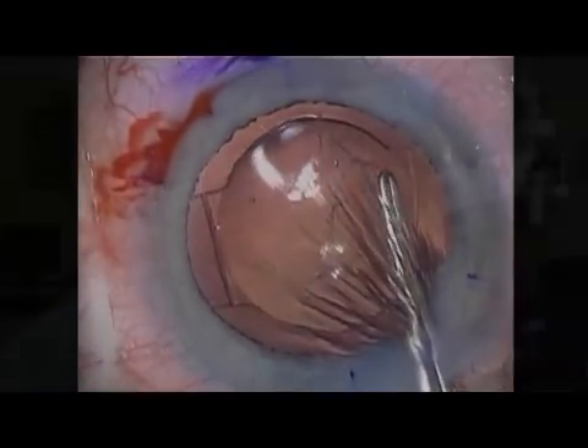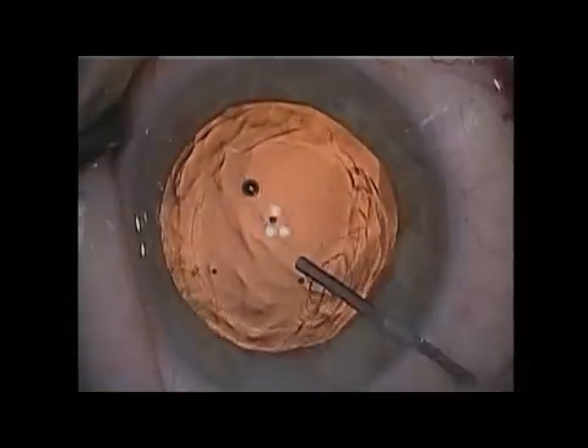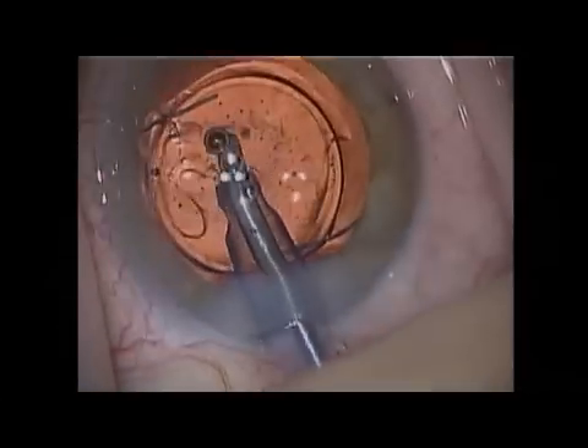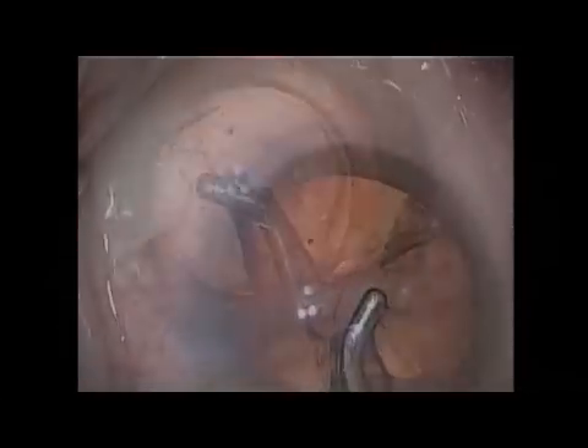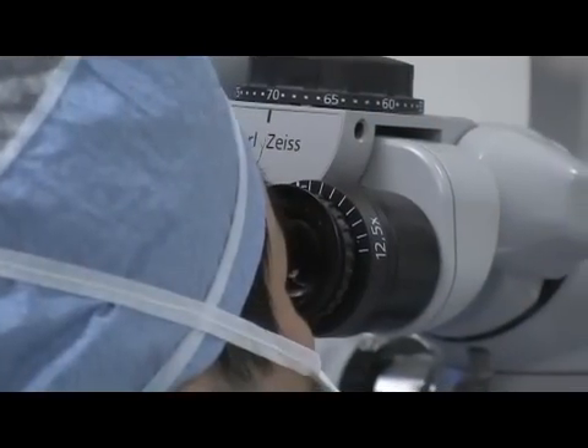In terms of the image you're seeing on the screen, what it does capture is the really enhanced red reflex. That's because this is the first system where the illumination is actually at a zero degree coaxial direction with your oculars. So you get a very bright red reflex — I call it a jack-o-lantern view, because it's like you put a candle inside the eye and it's just glowing. You can see that very well in the video. Of course, what you don't see on video is the three-dimensional depth that you get with your stereo surgeon's view, where you can really see different levels of anatomy inside the capsular bag like I've never seen before.